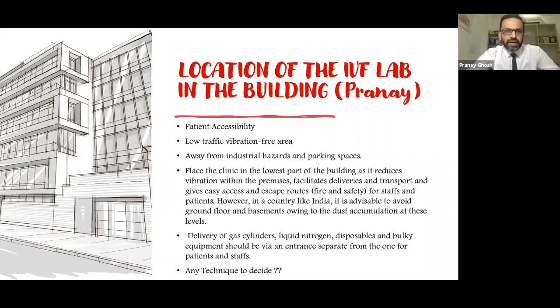Once you've decided where you're going to start your lab, it is always a good idea to bring in your environmental engineers to do a baseline check for the particulate count with regard to PM2.5, PM5, and PM10, and do serial testing of the VOCs. This gives us an idea of how polluted an environment we are looking at, and whether we need to install additional measures for air purification before we decide to start the IVF embryology suite in that unit.